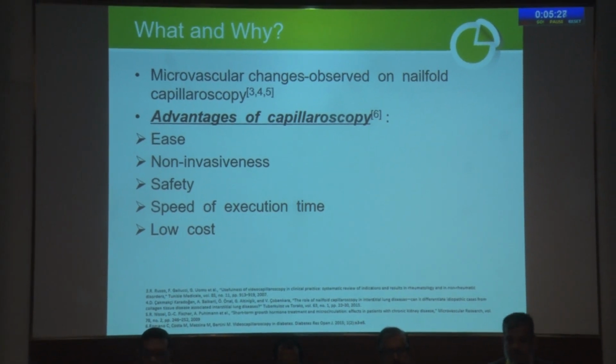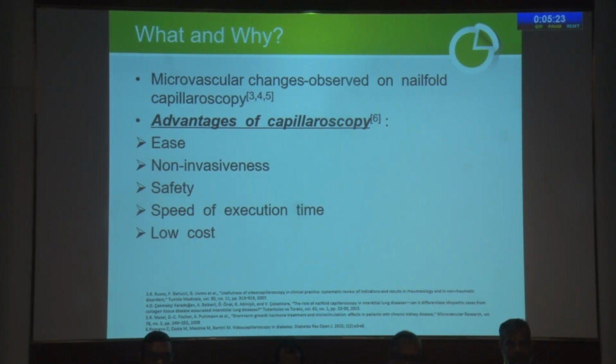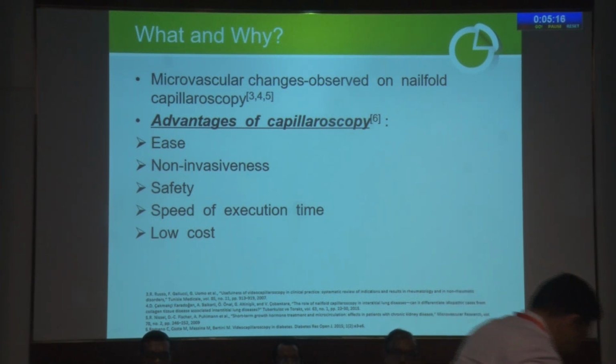So what is this? Basically, we are examining the nail fold capillaries by using a device called nail fold capillaroscopy, on which microvascular changes are being observed. Its advantages are its ease, non-invasiveness, safety, speed of execution time, and low cost.